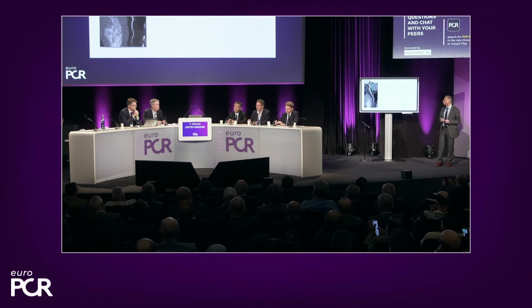Well, thank you for that question. It is a complex patient, and I totally agree with what we have said before. So my first concern is that there is a high bleeding risk. I would like to reduce the use of oral anticoagulants in that setting and DAPT, which means that I would like to do as simple a procedure as possible, reduce the metal, and do what I need to do to solve the angina problem without putting in too much metal.